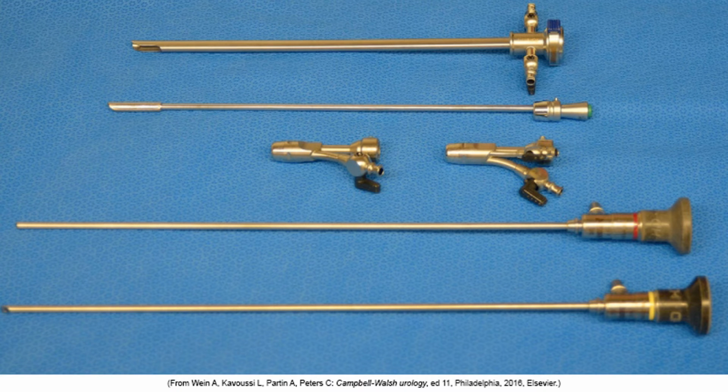So again, this is just another image. Here up top is our sheath with our inflow and outflow ports. And you can see where we want that obturator in there when inserting it, because these are very fine metal edges. We don't want to cause any injury. This here then is our obturator, and you can see how that is a very rounded and very blunt tip. So this will slide into this portion. Here are 2 different bridges with their working ports here. Our telescope center down here, they're going to slide through the bridge here. Once this obturator is removed, this entire piece then is going to slide through here and connect.